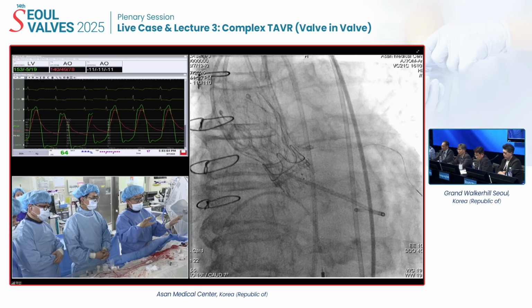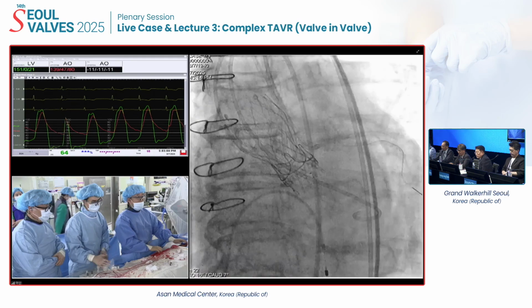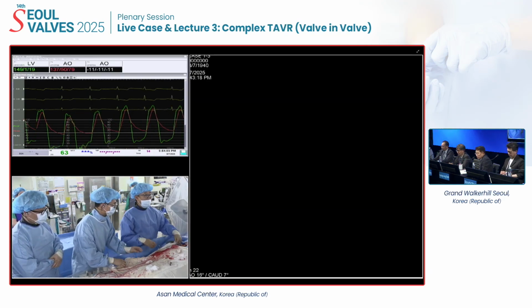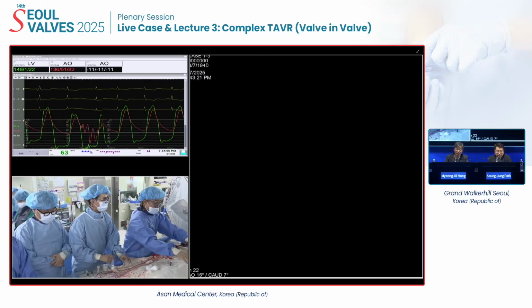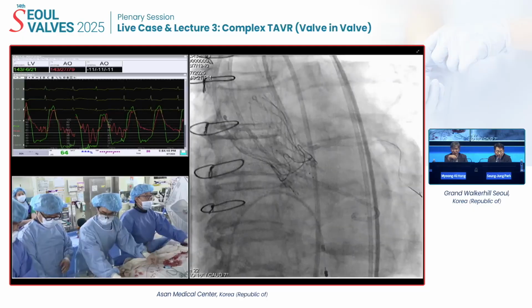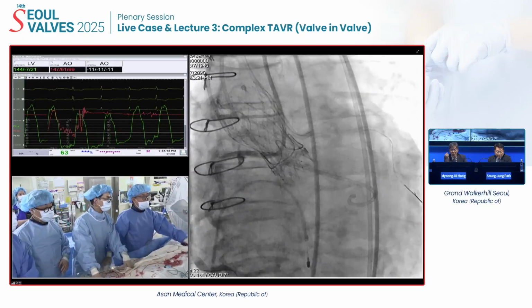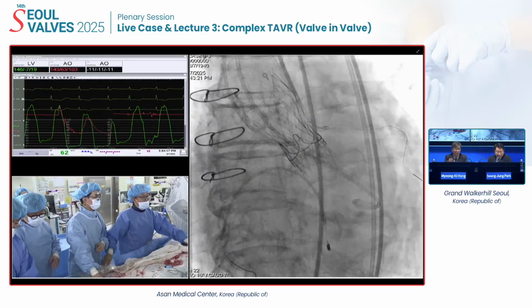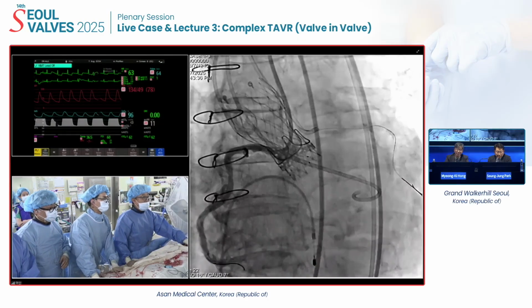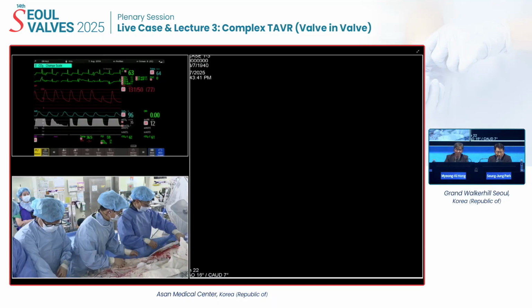The reason why we put the both coronary artery protection system, and then we will check both coronary arteries, in the right를 먼저 한번. 자, 요게 라이트인가? 자, 이거 테스트 한번 할 수 있어요? If you have a time, the rotational fluoroscopy and the transthoracic echocardiographic finding. 오케이, 한번 찍어보자, 라이트. 오케이, it's good. I think the space is good. And the left도 한번 찍어보자.